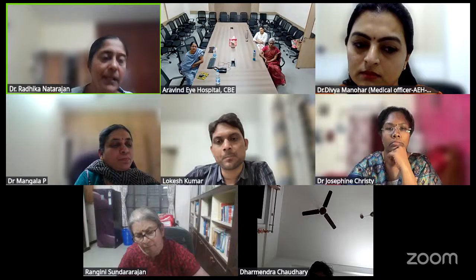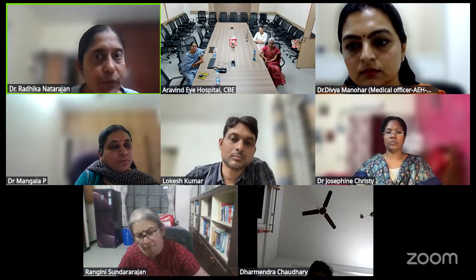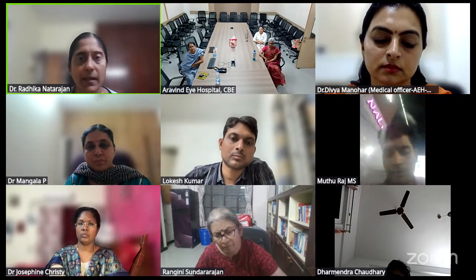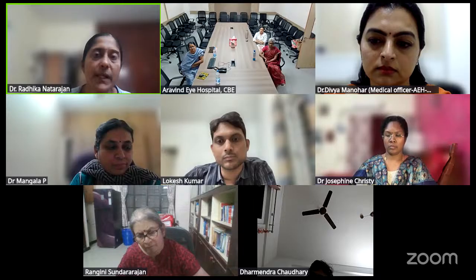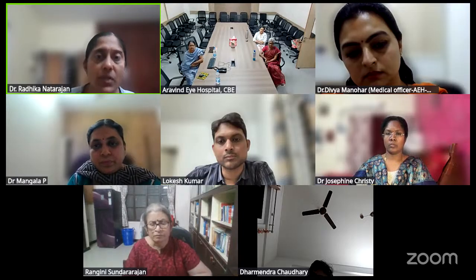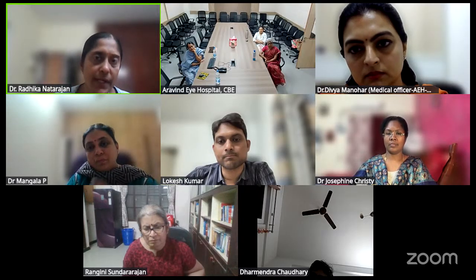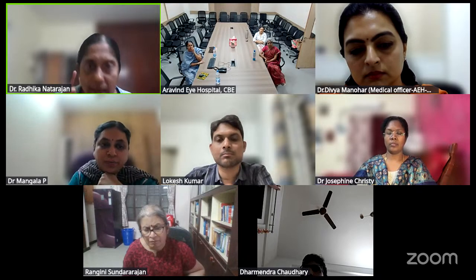So I firmly believe that every patient should undergo at least a trial of scleral contact lens, if possible, usage for 4 months before going to a DALK. But there is the converse also. I have a lot of faithful contact lens users in my keratoconus practice. But PROSE is only going to give the vision in terms of correction of the ectasia, a little bit of scarring. It's not going to give any support to the cornea. So these corneas sometimes are not cross-linkable. You have 300, 250 micron scarred corneas, which are improving to 6/9 with PROSE. Then what do you do? You continue PROSE because the patient is tolerating it with good vision, or you do DALK worrying that they will go for hydrops. So that fear is also there.